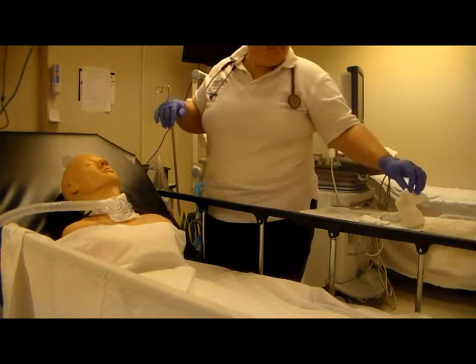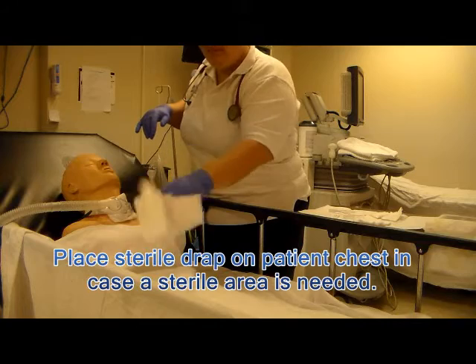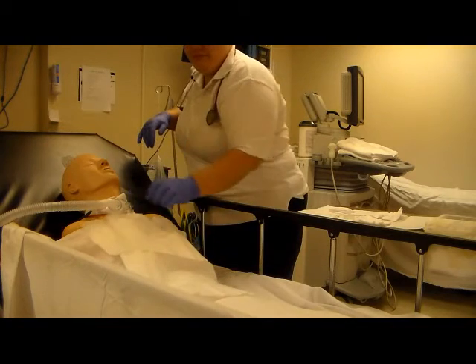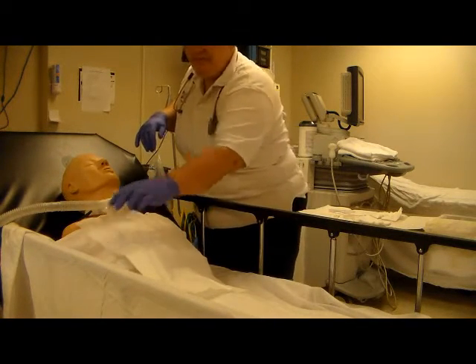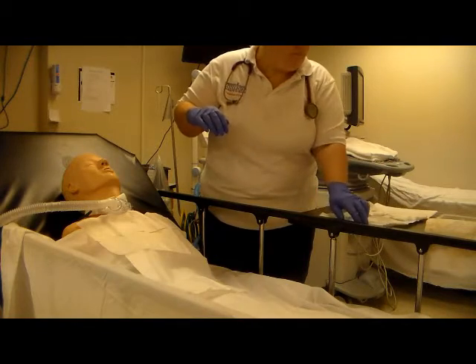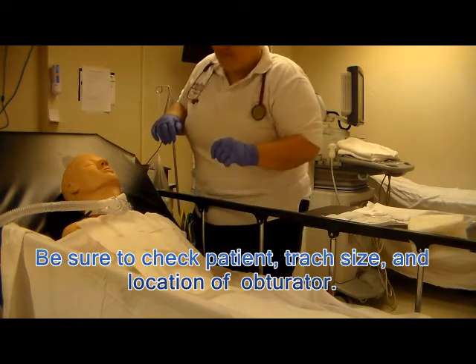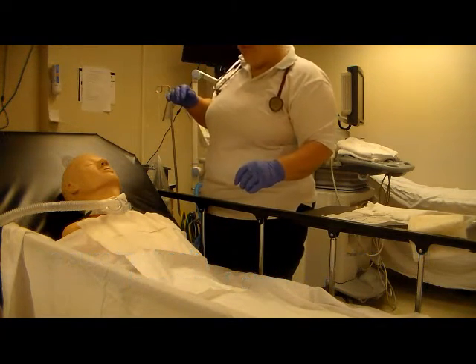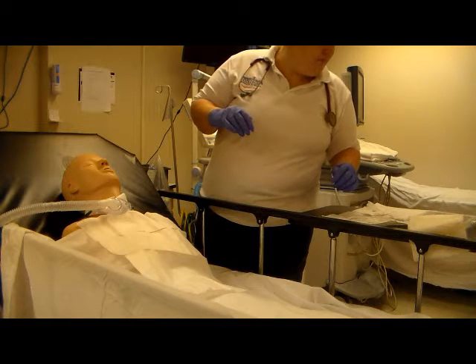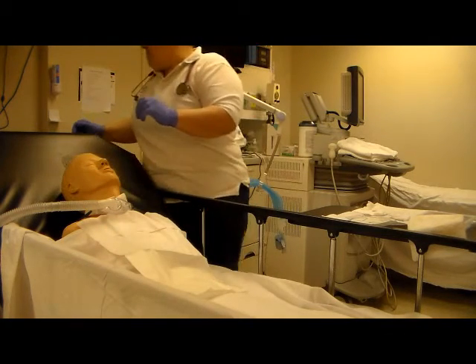At this time take your sterile drape and place it over the patient's chest in the event you need an area to set something sterile down. At this point we've completed the common elements: hand washing, preparing ourselves, and introducing ourselves to the patient. You'll want to make sure you've identified the size of the trach tube and airway in the event you need supplies. You'll have opened the kit, filled the basins with saline or water as well as hydrogen peroxide, and if needed also suctioned the patient.